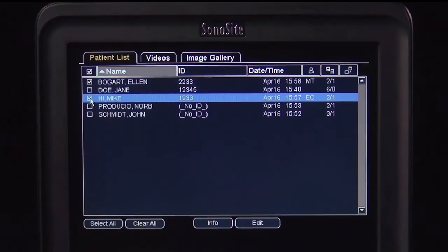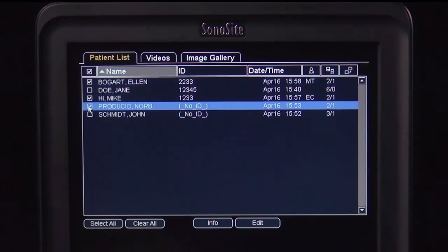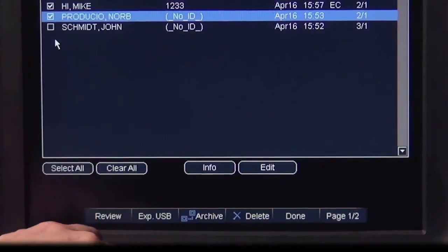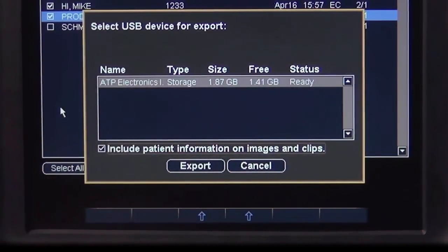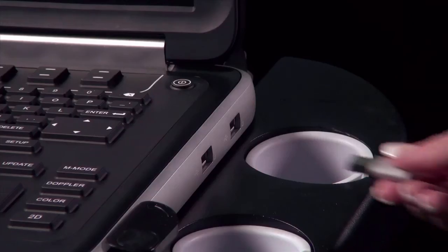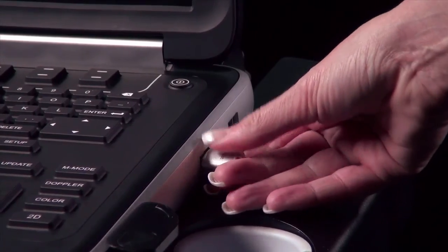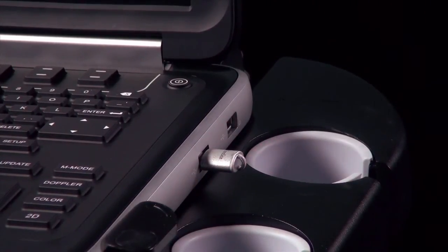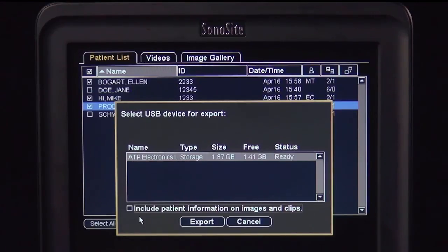Notice each patient exam has a check mark to indicate it is included. Once you have completed the selection, select Export to send all images to the USB device or archival device. Leaving the box blank will remove the patient's identifying information from the images or clips. Up to three USB devices may be connected to the system at one time. Select the USB device prior to exporting images.